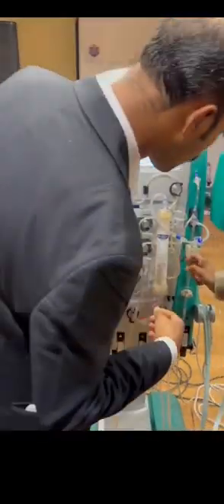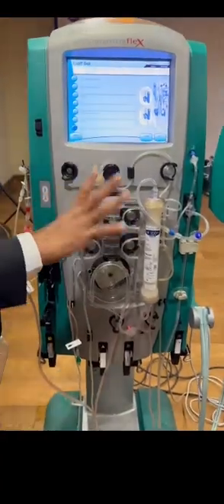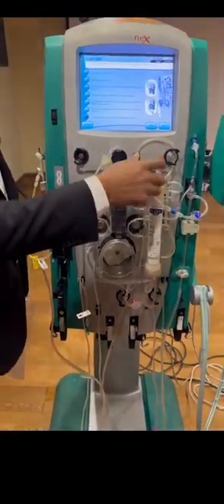Are these pipelines attached to the cartridge? Yes, it is already attached. When the pack comes open, yes, the cartridge, we cannot remove any of this.